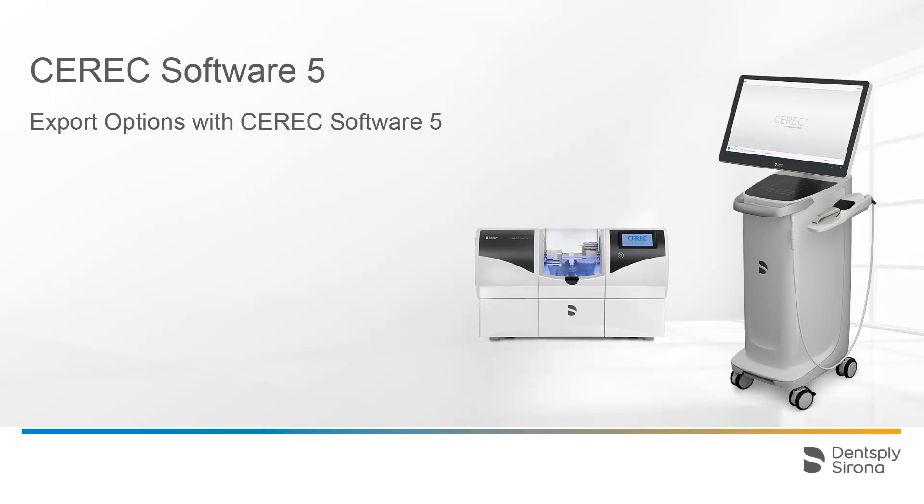Welcome to this video tutorial on the topic of export options with the CEREC software 5. In this tutorial we will demonstrate the different export options from the acquisition phase to the manufacture phase.